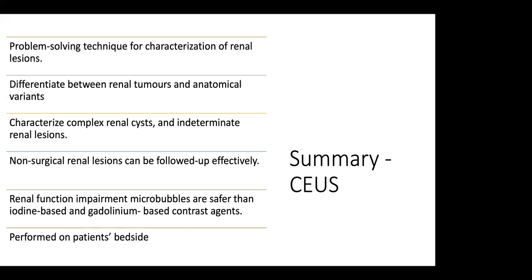After the urologist's opinion, we like, as urologists, to have a second look as well. So in this case, maybe we need to rely strictly on the word of the formal report instead of having a direct visual idea of the exam, of the imaging.